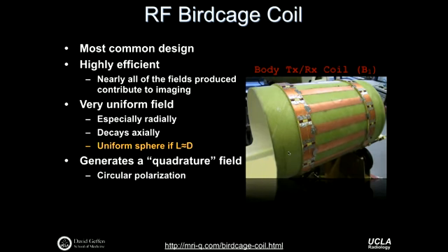And it's the hardware component that ends up being, in terms of the MRI scanner, the hardware component that's closest to the patient. We'll usually have coils as well, receive coils. They're a head coil, a knee coil, things like that. So that'll be even closer to the anatomy of interest. But with regards to the concentric ring that makes up the whole scanner, this hardware component is closest to the patient, if you will.